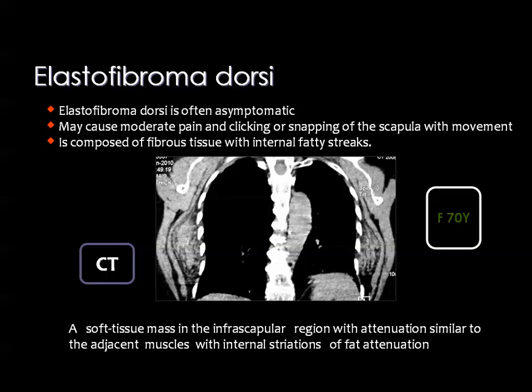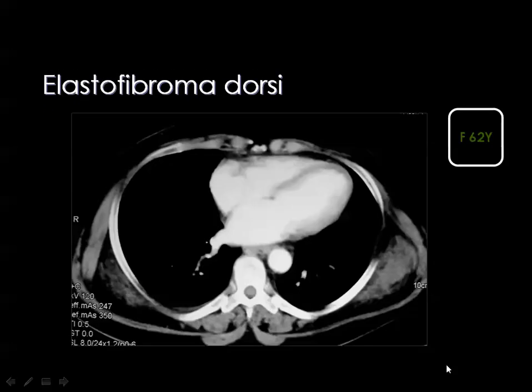Then she consulted one of the physicians, who advised an imaging modality like CT, for example. Whenever this lesion is misdiagnosed as a soft tissue tumor, which may be a sarcoma, for example, then a biopsy will be resorted to. But whenever you see the classic location of the lesion, the classic appearance and the strands within the lesion, then you know that this is a benign lesion which does not need any interventional maneuvers at all.